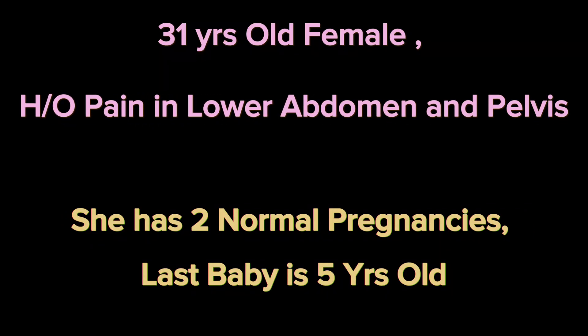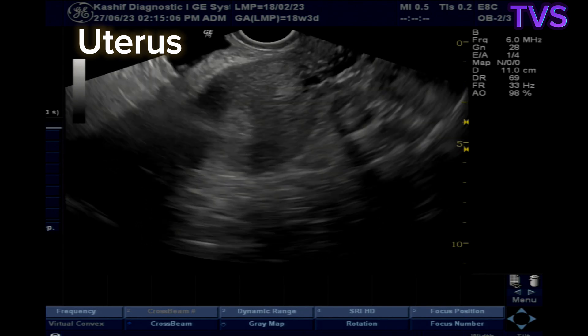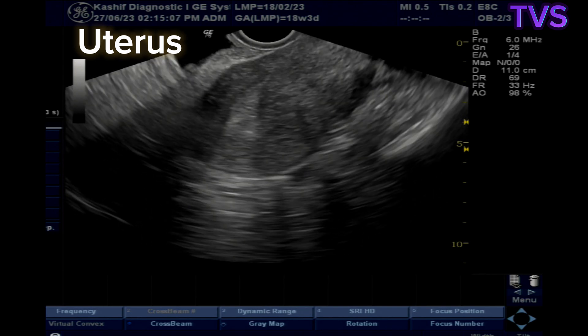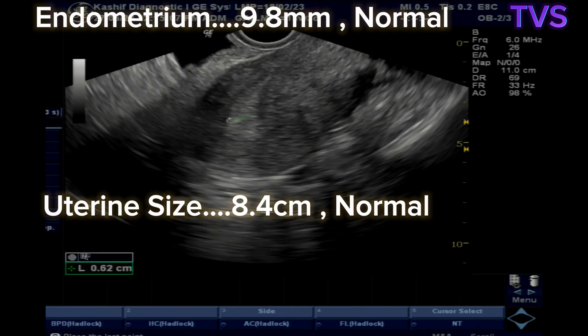This is a 31-year-old female with a history of lower abdominal or pelvic pain. A pelvic ultrasound is performed to find the cause.